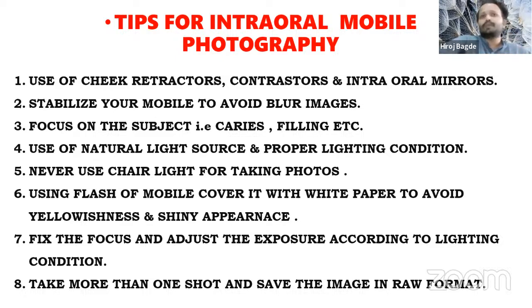So I will tell you, fix the focus according to lighting conditions and take one or more snaps, because getting everything perfect in one shot is not possible even for DSLRs. We have options in a few cameras for the image to be saved in raw format. Yesterday I told you we have to have raw plus JPEG.